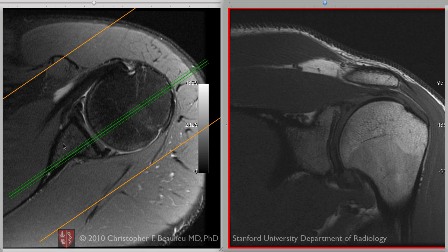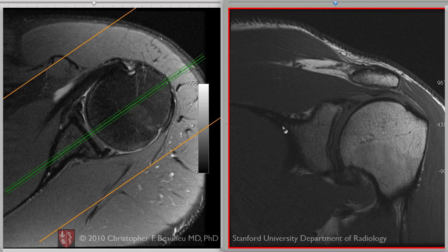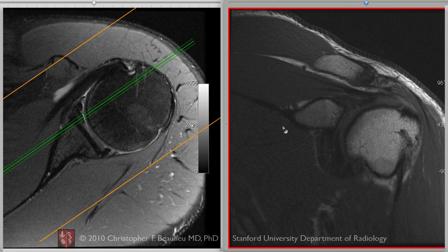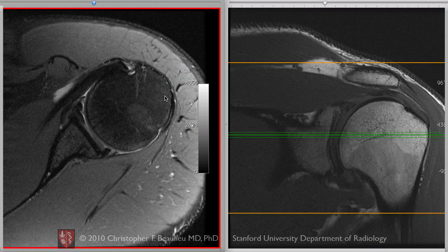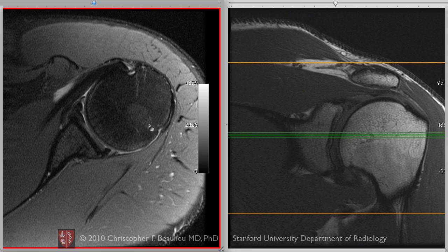You can see the orientation of that T1 weighted scan relative to the axial here, and scanning back and forth. I'll stop on the coronal, but the axial image is what I want to focus on.